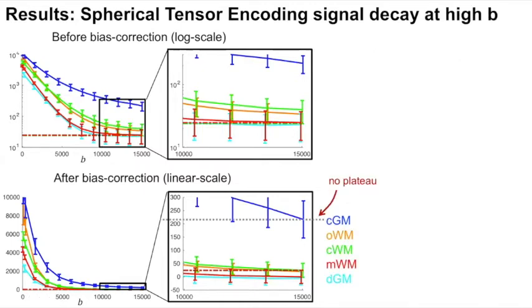So if we go with the assumption of a complete dot compartment, we would expect this plateau here. But as we can see, for none of the compartments except the ones that hit the noise floor, the signal is really plateauing. But still, we can use this signal at the highest B value as some kind of upper estimate of this dot signal fraction.